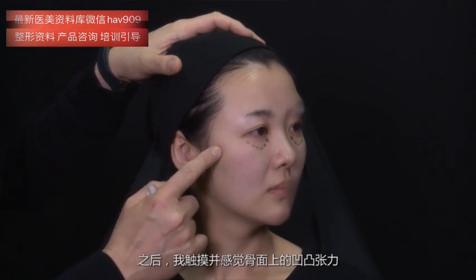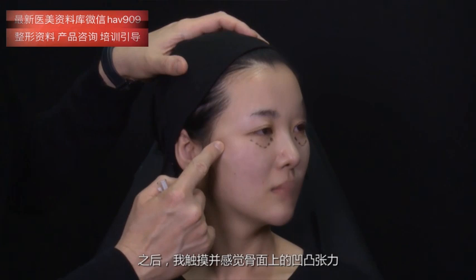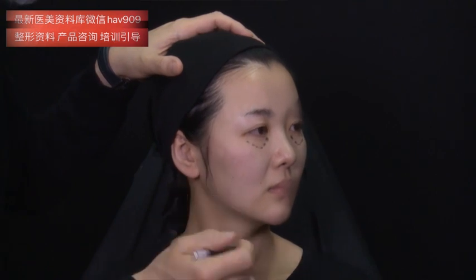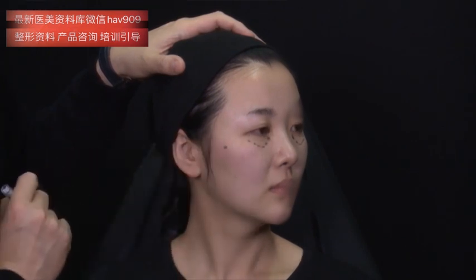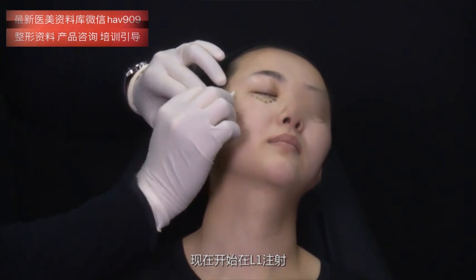After this, I palpate to feel the presence of the indentation on the bone. And this is where I mark L1. Now let's proceed with injection of L1.